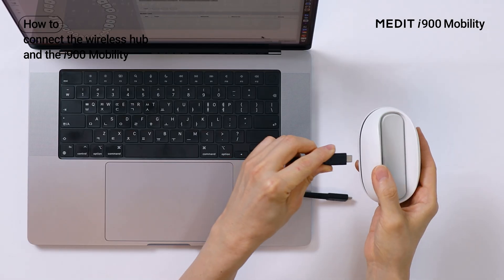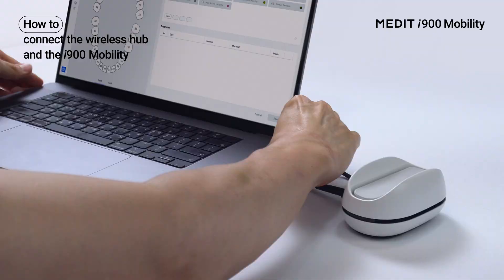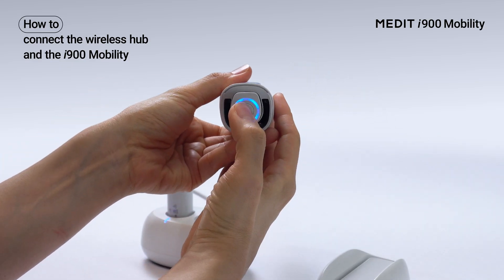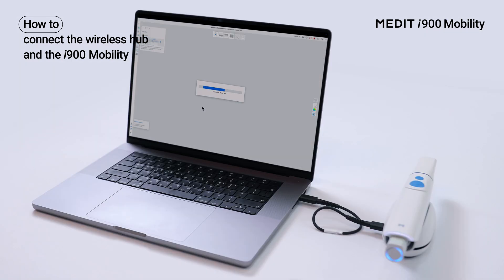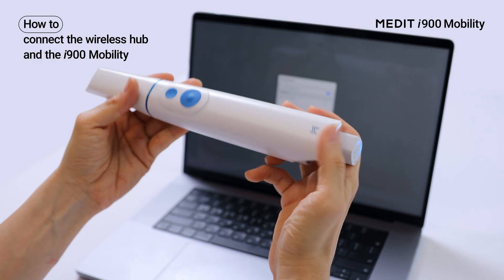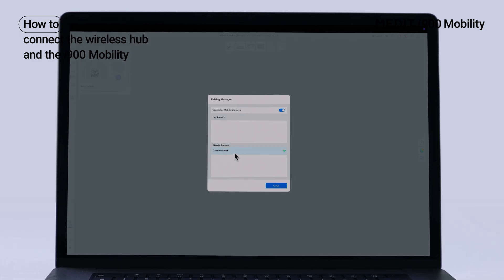Connect the power delivery cable to the wireless hub and plug it into your PC. Turn on the scanner with the battery inserted. Open Medit Scan for Clinics and check the hub connection. From pairing manager, check the nearby scanner's serial number and pair it. You can find the serial number on the bottom of the scanner. Once paired, check your registered scanner under My Scanners.